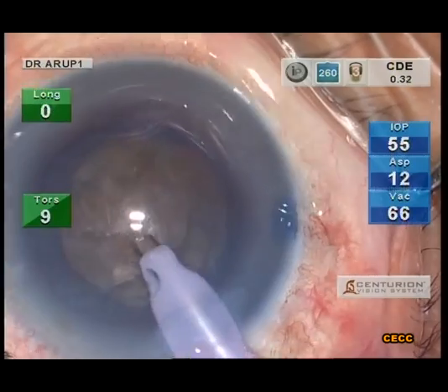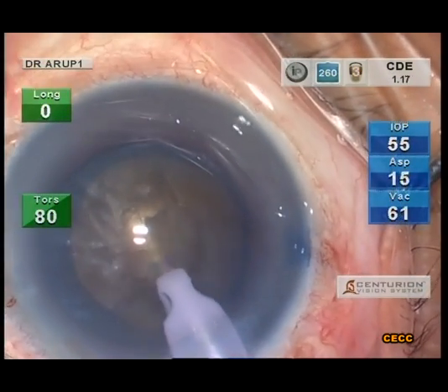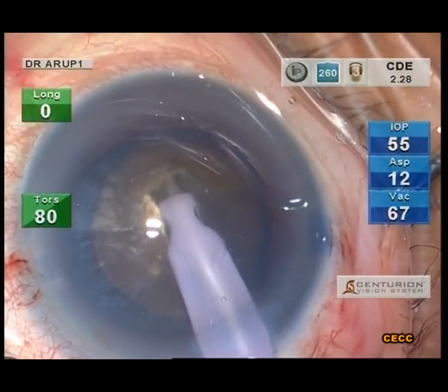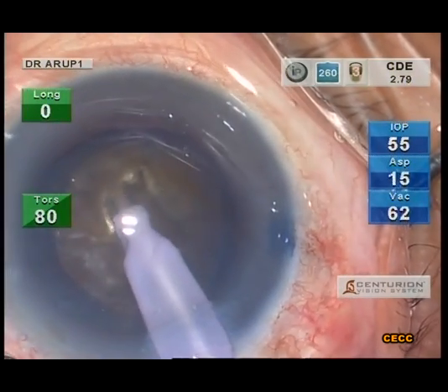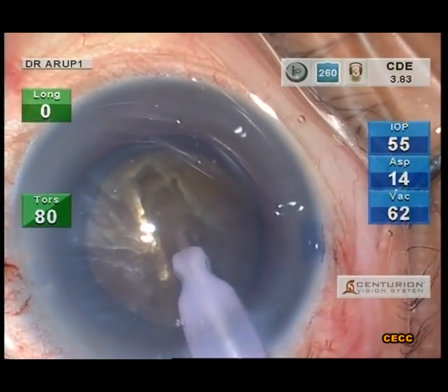In this case, the central groove is sculpted using 80% torsional phaco and a balanced tip. The aspiration may need to be stepped up to facilitate rapid clearing of the lens milk which is generated during the sculpting maneuver.